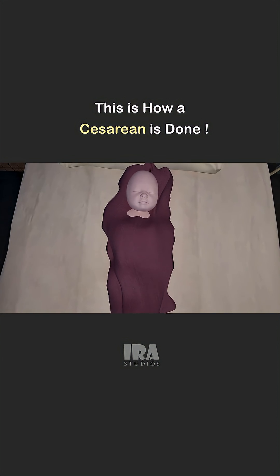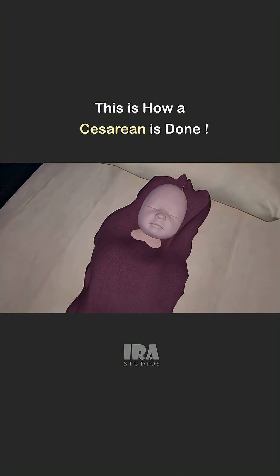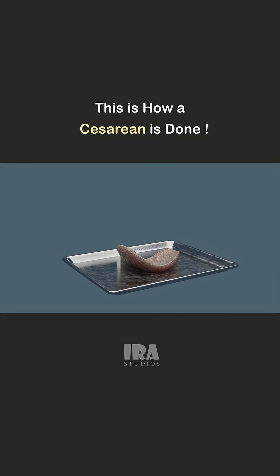After that, for the first observation, the baby is wrapped in a warm towel. The placenta is carefully removed.